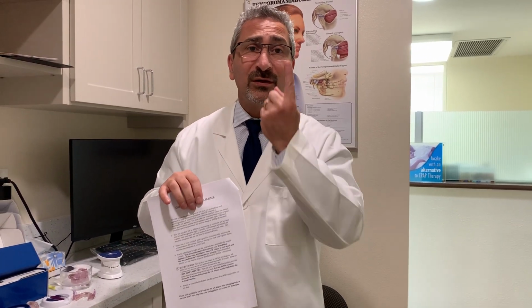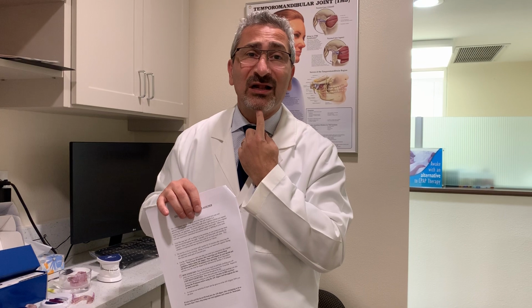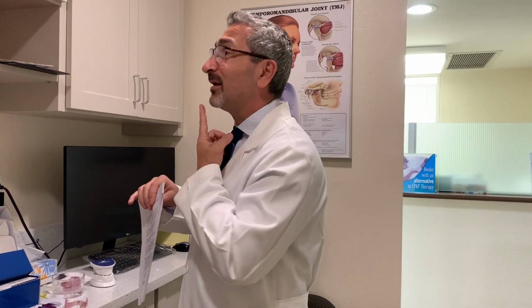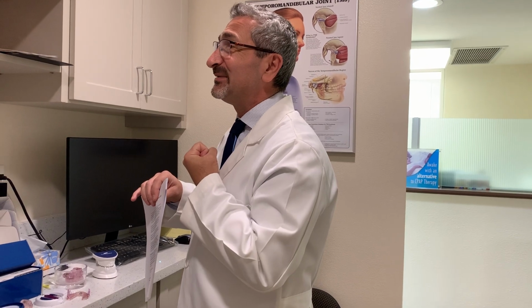So one of the bite exercises here, you put your tongue to the roof of the mouth, pull it back, and bite on your molars. So it's going to look something like this. Tongue back, and if you watch my chin, and bite on your back teeth.